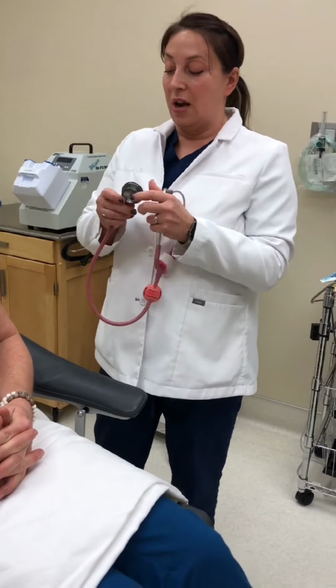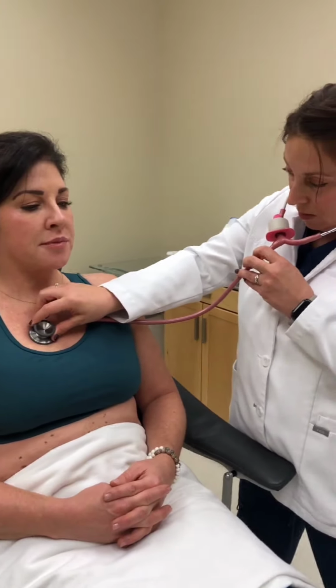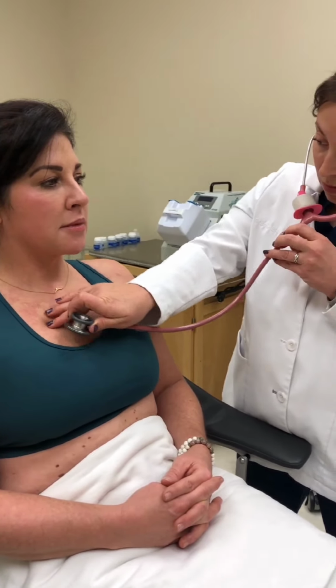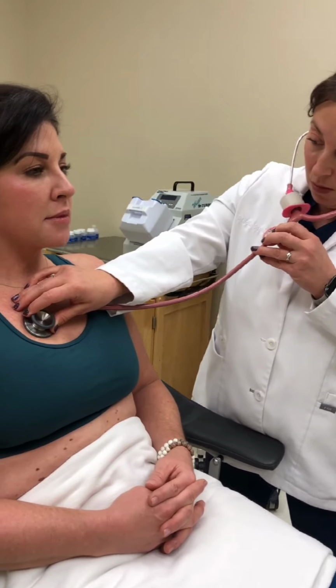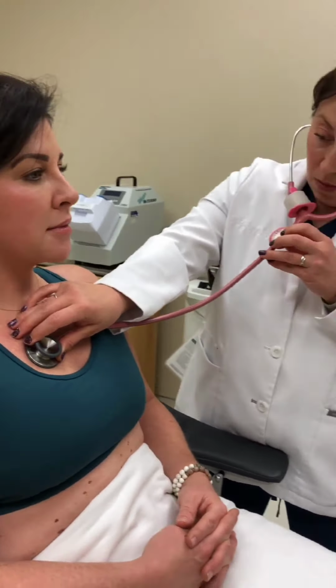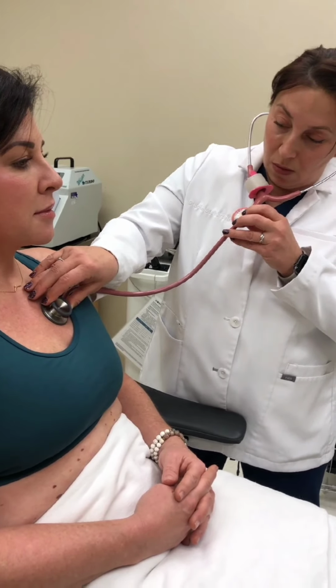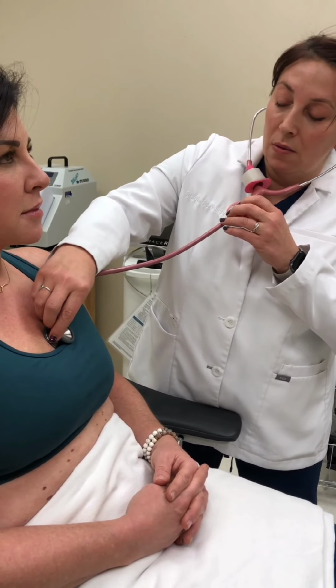And I'm going to listen one more time in this position here. Pulmonic and Erb's point.